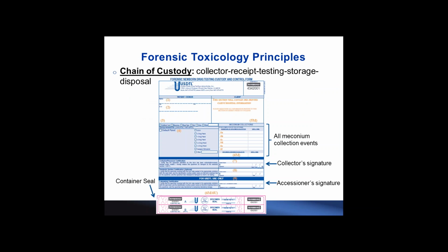And we always just treat it like the forensic toxicology principles. The catch is we may or may not have a much lower cutoff than the adult urine type, and that is something that we need to work out between the clients and the client services. It would be very client specific when we have such a cutoff difference request.